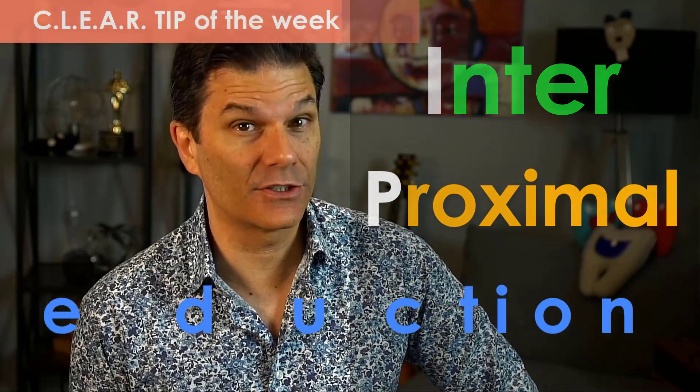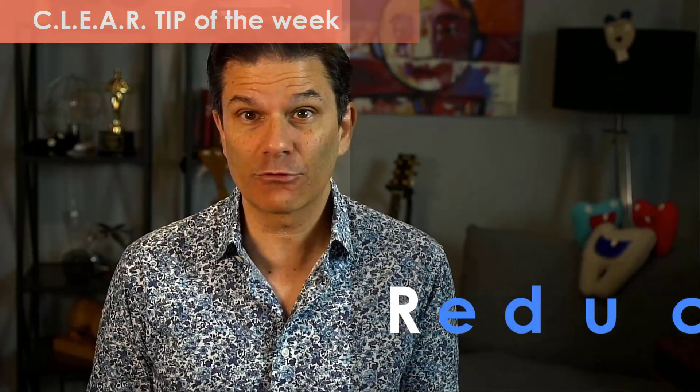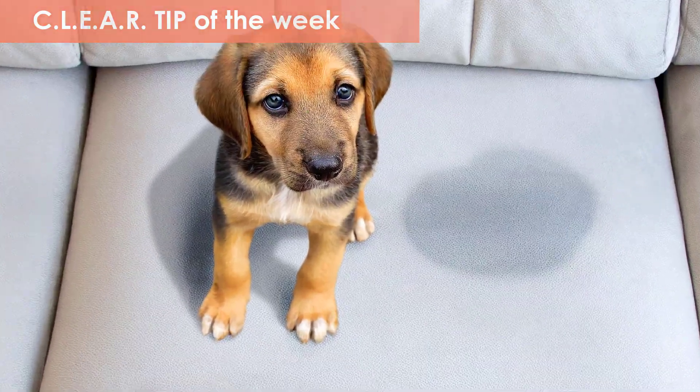Are you afraid of IPR — interproximal reduction? A commonly used method to create space and eliminate crowding in the permanent dentition. How? By removing enamel. But wait, is it causing more cavities? Is it creating permanent damages? The answer is in this week's clear tip.